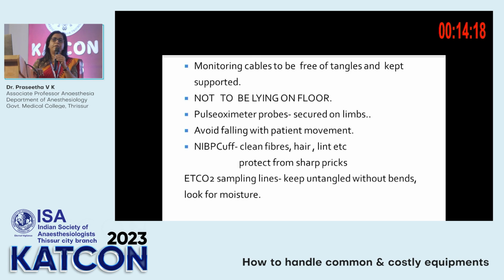For the NIBP cuff, I have seen numerous things on it, like threads, fibers from the linen, sometimes patient's hair. So please clean all those things from the NIBP cuff, and protect the bladder of the NIBP cuff from sharp pricks so that there is no leak when you are measuring the blood pressure.